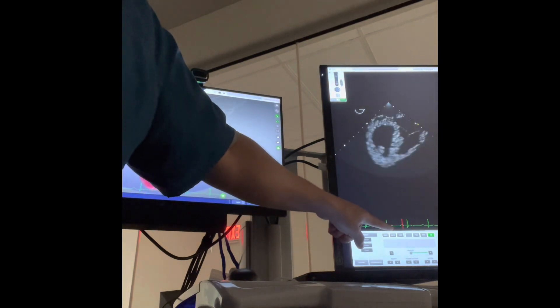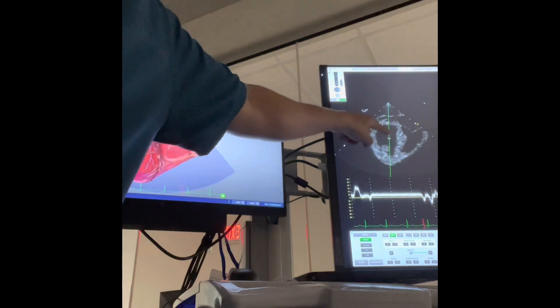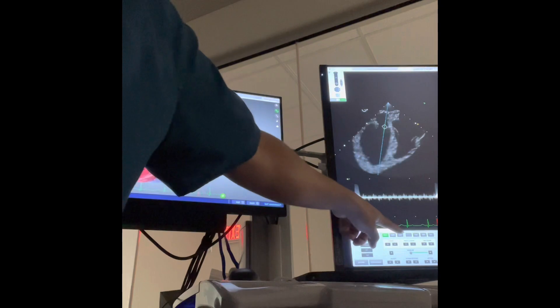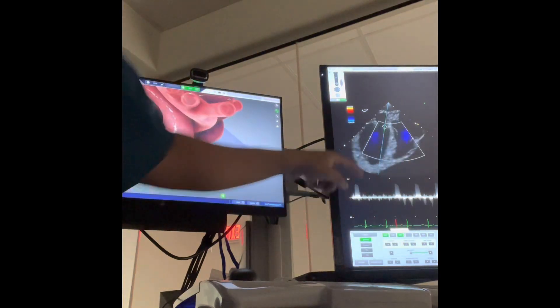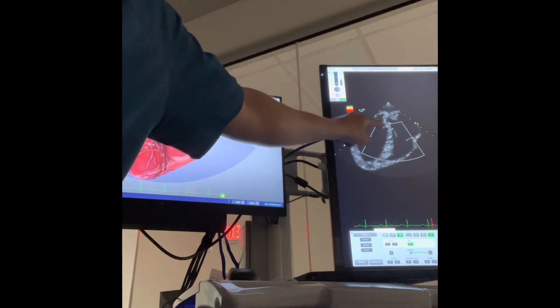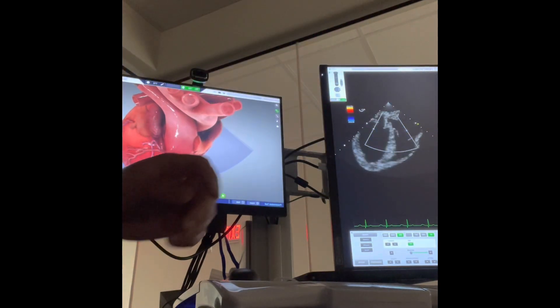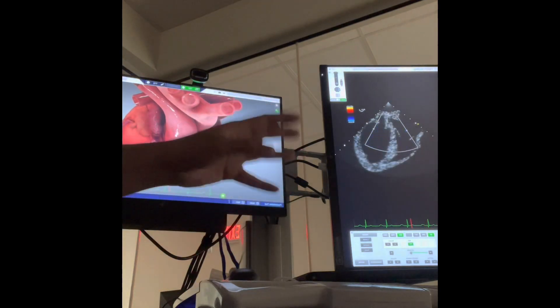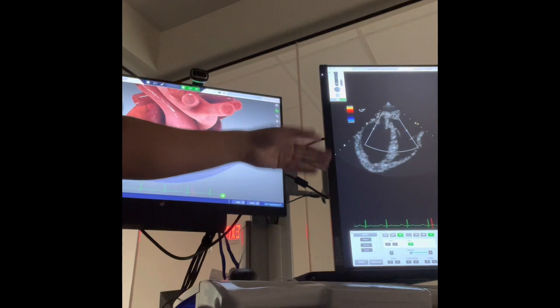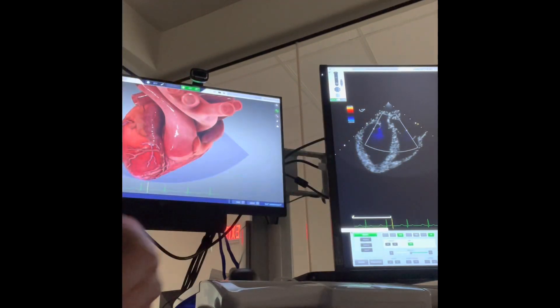I could do anything like, for example, if I do a pulsed wave Doppler, I can do my VTI, I can do my color Doppler — I can do anything on her as I would do with the normal TTE. It can actually let you do all the measurements and everything that you would do normally in a patient like that.